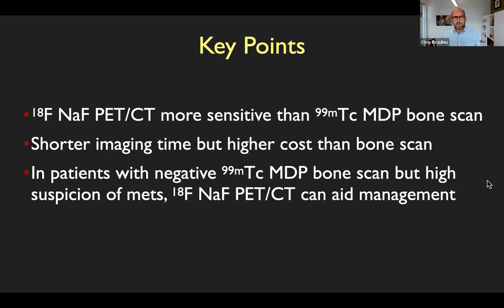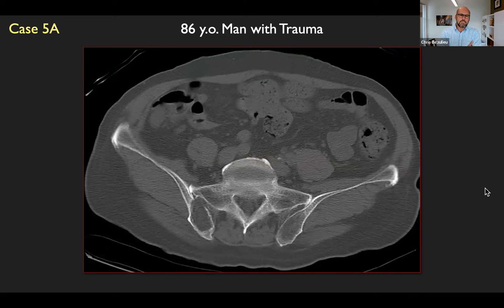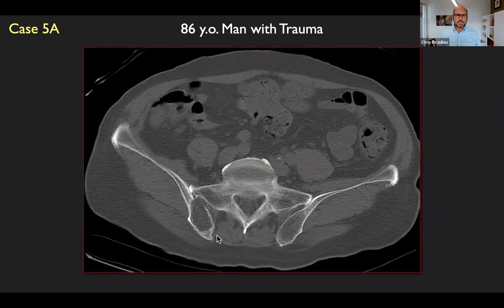Here's another case — an 86-year-old man who fell down some stairs. You get a pelvic CT because the radiographs are poor and you see this lesion in the right iliac bone. Is it a metastatic lesion or a chondroid tumor? It doesn't have that chondroid matrix. It's fairly well-defined, a little hard to know — pretty large lesion. If I had to bet, I'd say it looks probably more well-defined and non-aggressive than overtly aggressive. Then here's a different study on the same patient — zoomed in — and there's actually a big defect in the bone posteriorly. Is that aggressive? There's a little bit of a defect here as well, so you could worry about this.